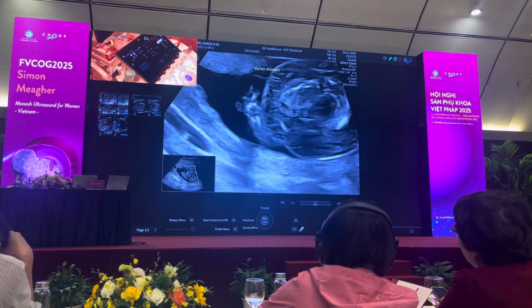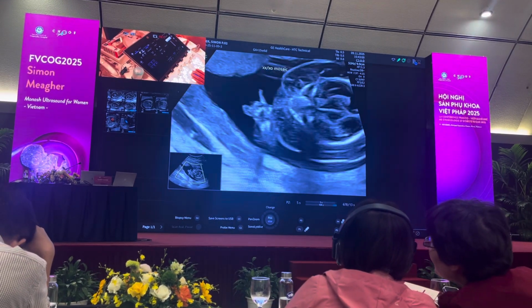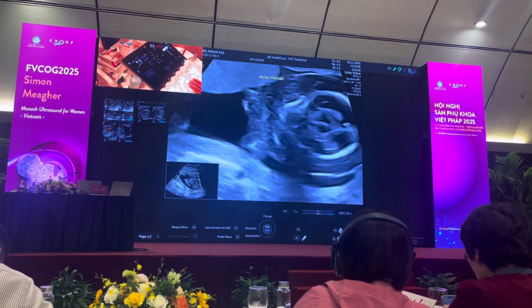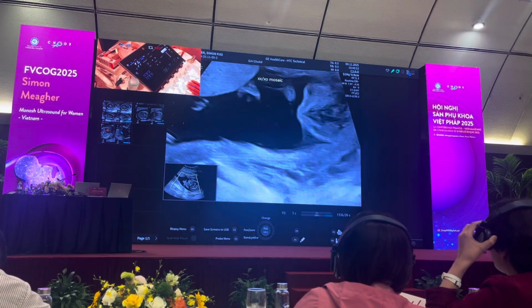Sometimes the baby's two hands are holding, so the babies are holding hands. It can make it look abnormal when it is actually normal, so then you shake the baby to try and get the hands to separate. And if it doesn't separate, then come back and look at the hands later. Abnormality of the hands is not a feature of Turner's.